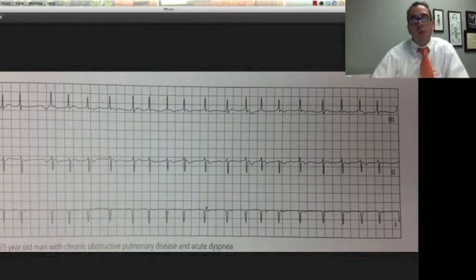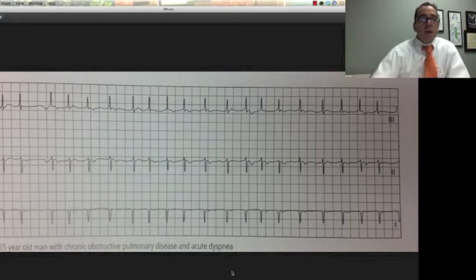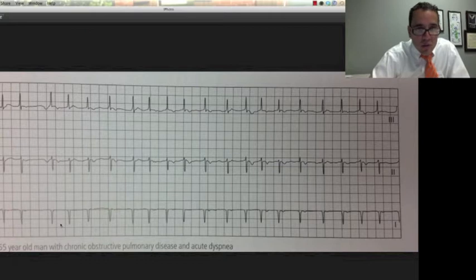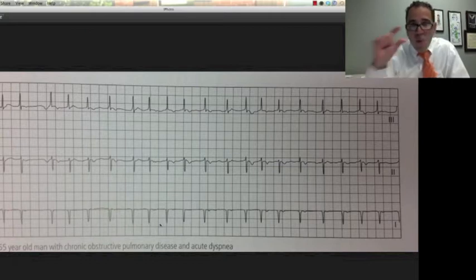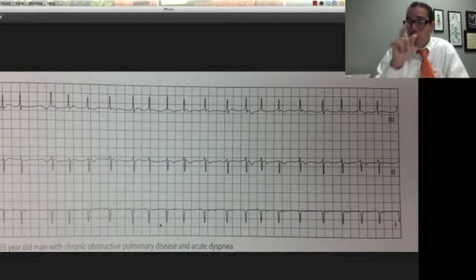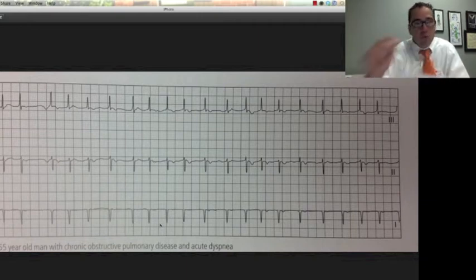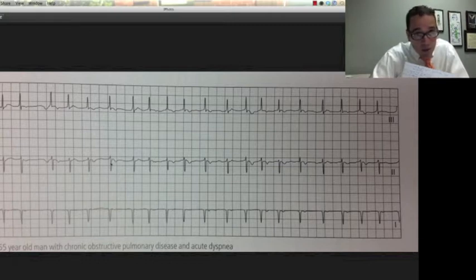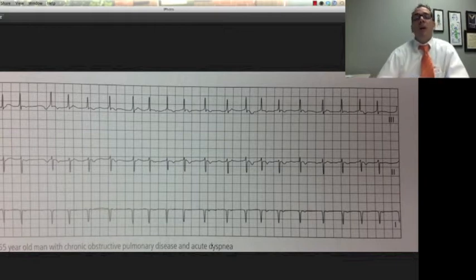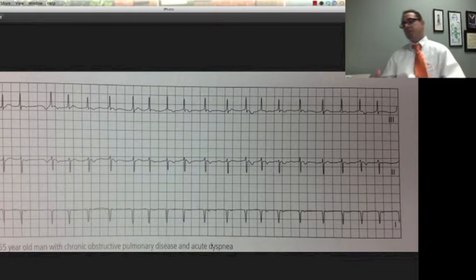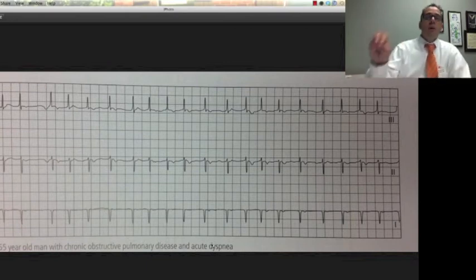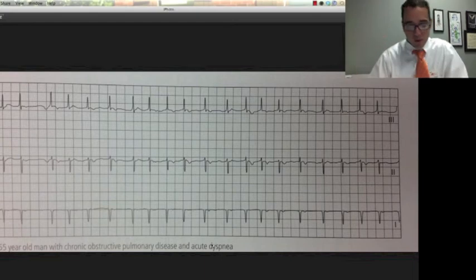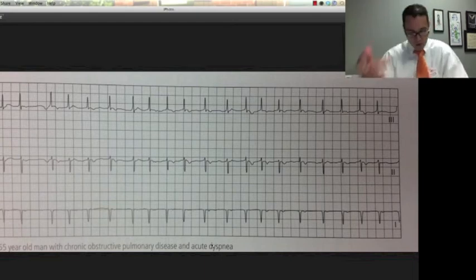65-year-old man with COPD — chronic obstructive pulmonary disease — and acute dyspnea, acute shortness of breath. Again, irregularly irregular. The QRS complexes are not even the same voltage, so consider pericardial effusion or something like that. But this one is irregularly irregular and we do have P waves. There's a P wave there, maybe a P wave here, and so on. This is multifocal atrial tachycardia. The main difference between that and AFib is that you actually have P waves, but the P waves look different — as many as three or four different types — some positive, some negative, some biphasic.